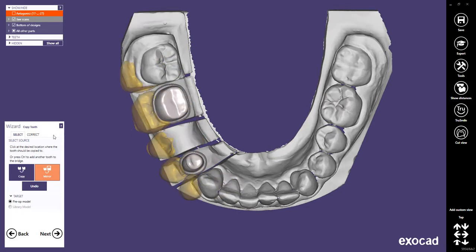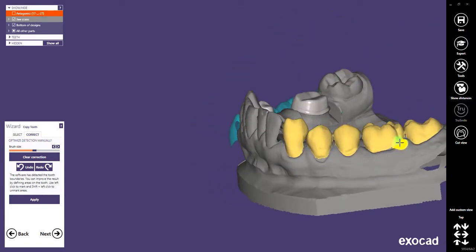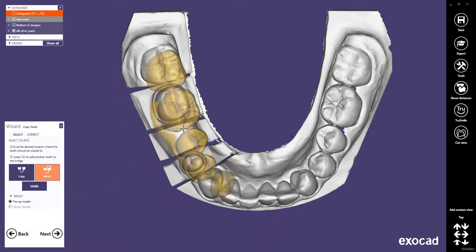You can also perform corrections on a series of teeth, but only with the brush tool. Changing the margin, as we'll be seeing it later in single-tooth mirroring, is not possible. You can use this brush function to add gingiva parts, for example, to your pre-op scan. Once you have finished adjusting the pre-op area, click Apply. Then position the block of teeth with a click approximately in the required region.